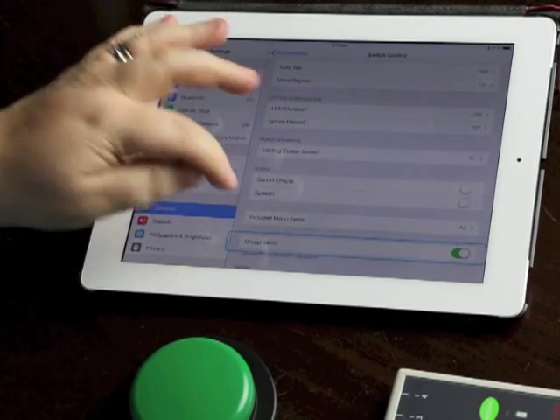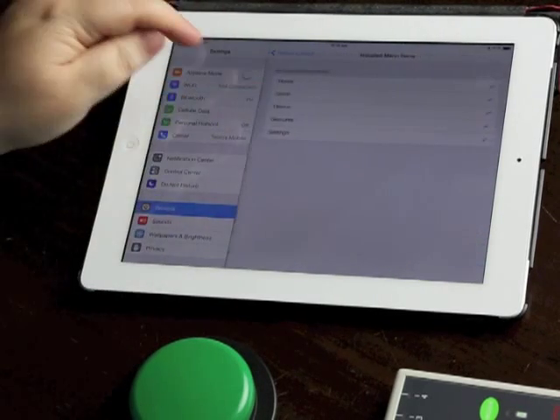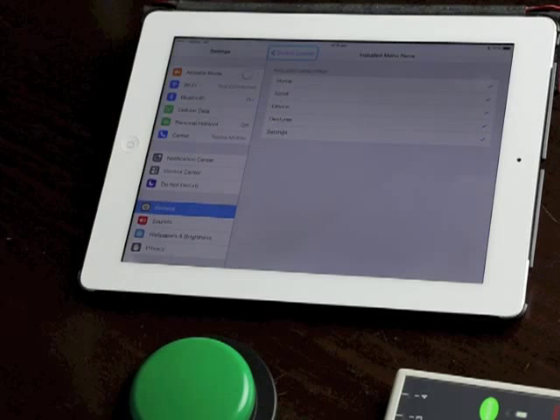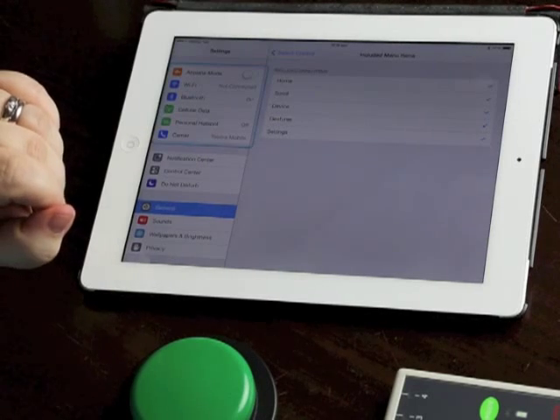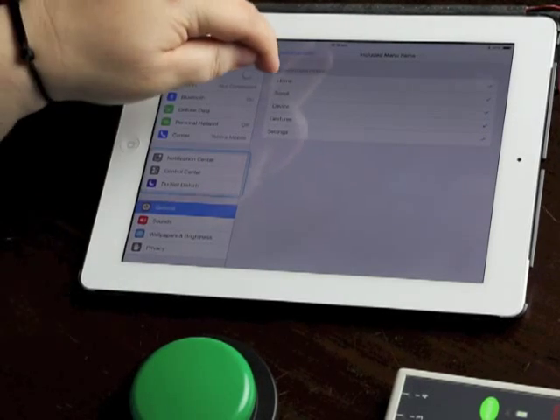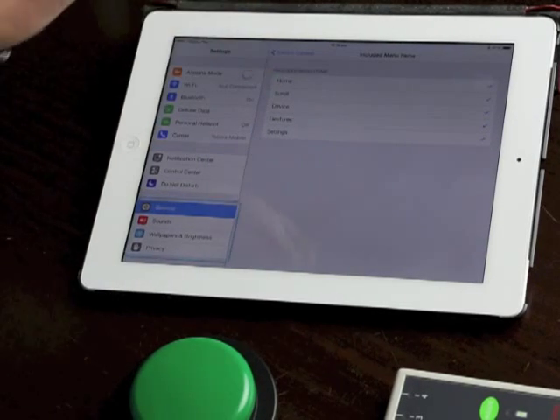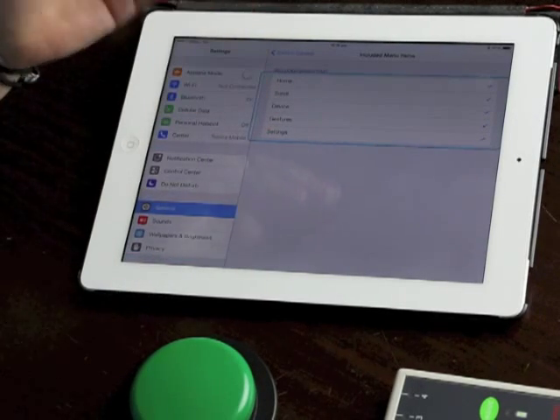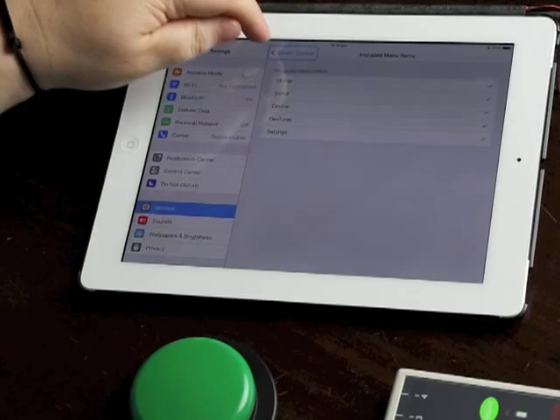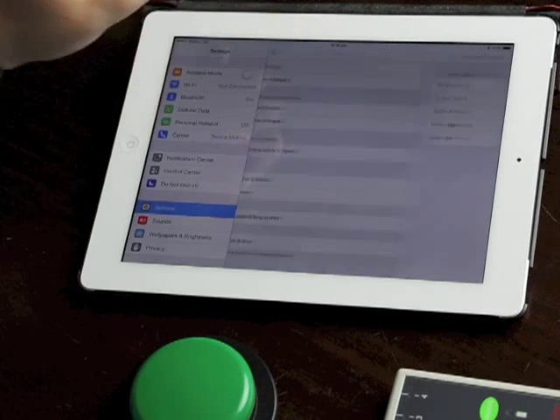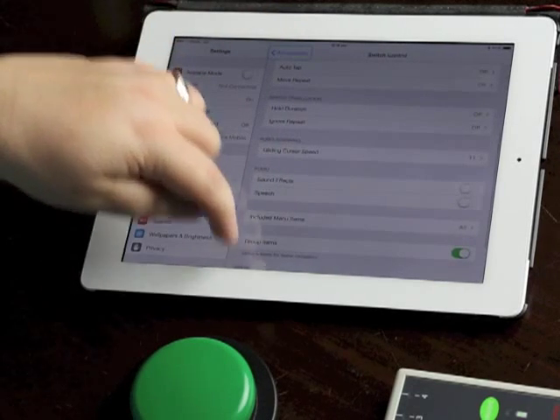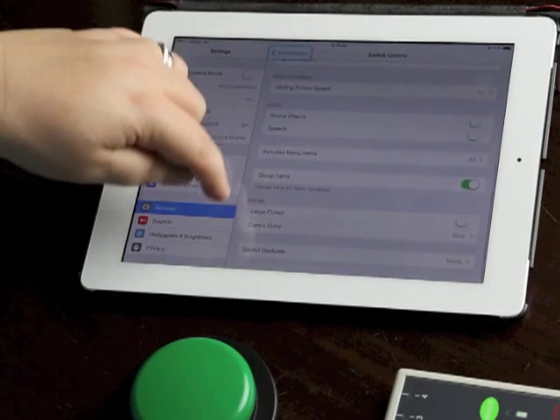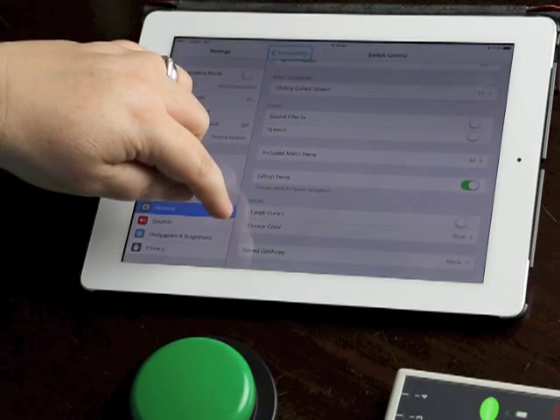Included menu items are all the things that are going to pop up when that little floating menu appears. So if you don't want home available or settings available you can turn that off in there and let's go down here.